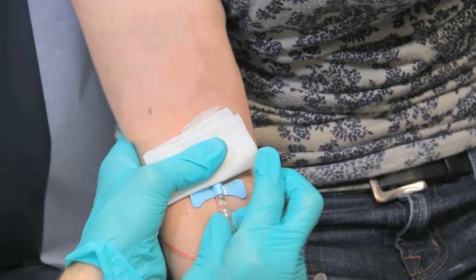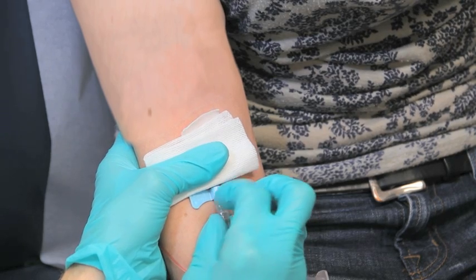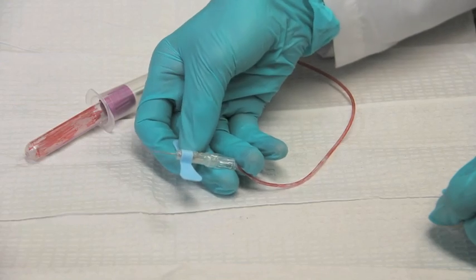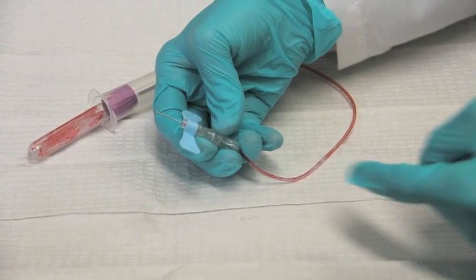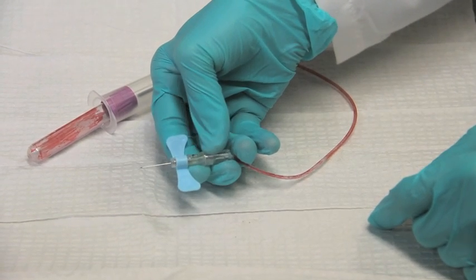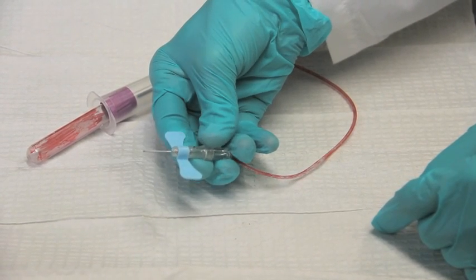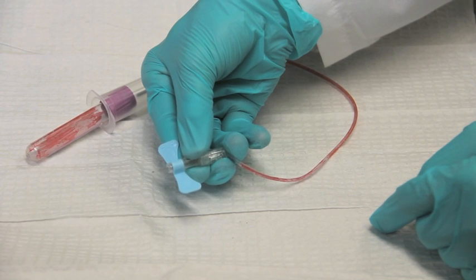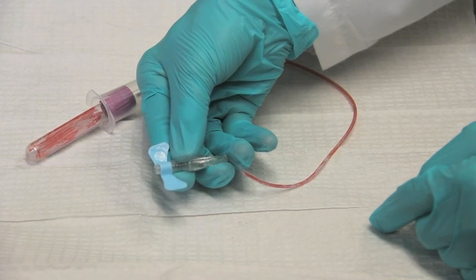To disarm the needle either press the button under a gauze while the needle is still in the vein, or place your third and fourth fingers firmly behind the spring and press the button with your thumb by rolling it from the wing to the button. Slowly let the needle retract by releasing pressure from your third and fourth fingers.